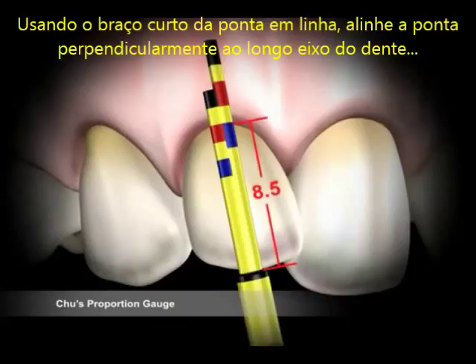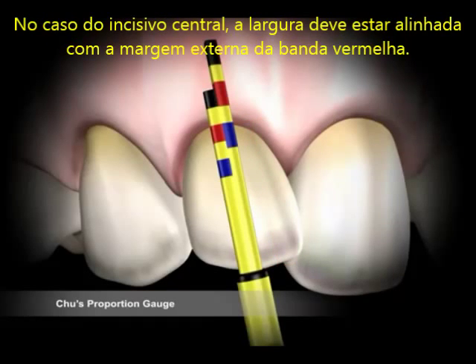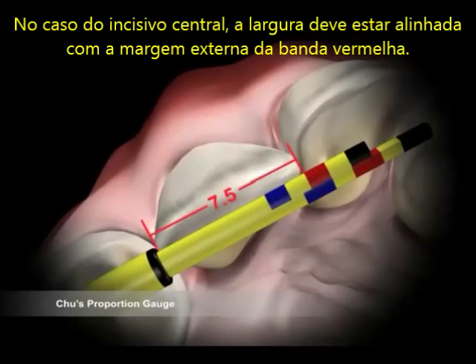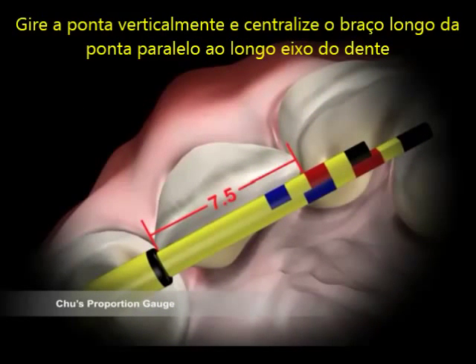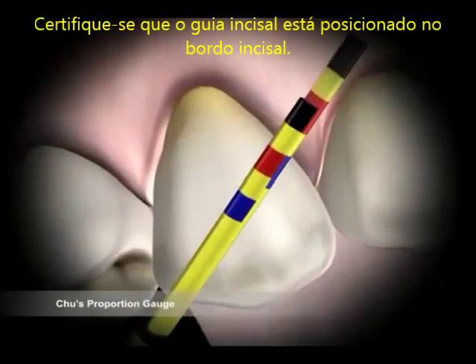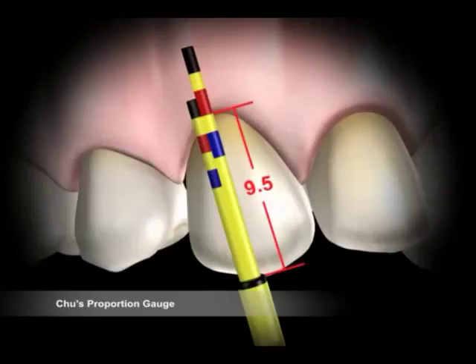Using the short arm of the inline tip, align the tip perpendicular to the long axis of the tooth to measure the width. In the case of the central incisor, the width should align with the outer margin of the red band. Rotate the tip vertically and center the long arm of the tip parallel to the long axis of the tooth. Ensure that the incisal guide is positioned at the incisal edge. The length should be at the outer margin of the red band on the long arm.